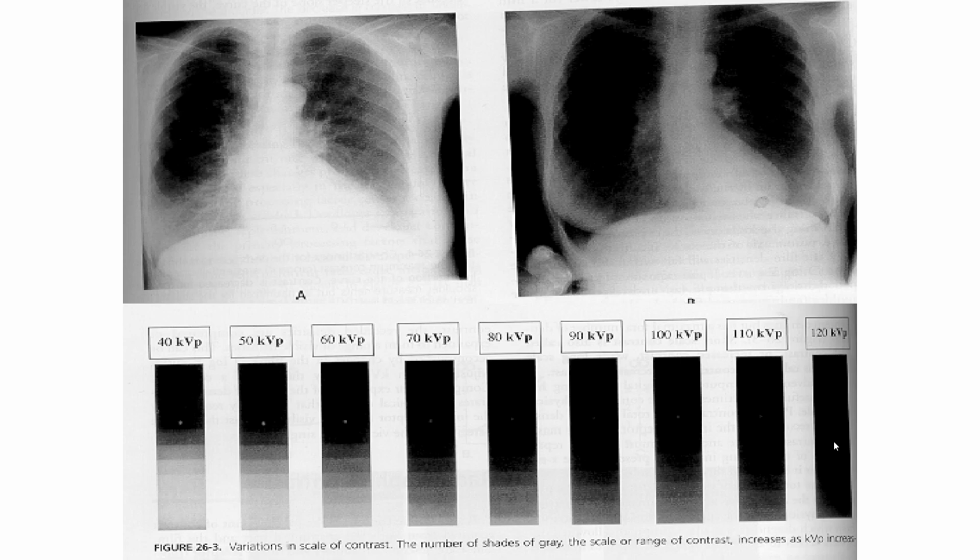Okay? Let us assume na pneumonia yan. At ginamitan mo siya ng high contrast technical factor. So palagay niyo ba makikita ng doktor o mababasa ng doktor yung pathology? Di ba hindi? Let's say, yung same person yung letter A sa letter B.